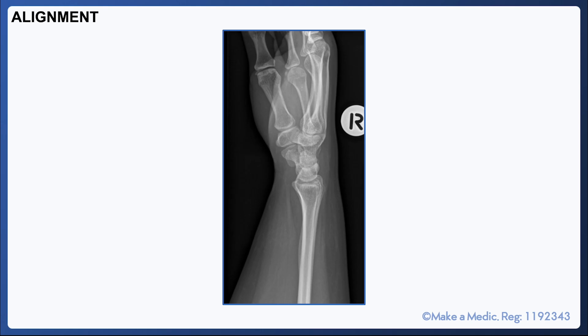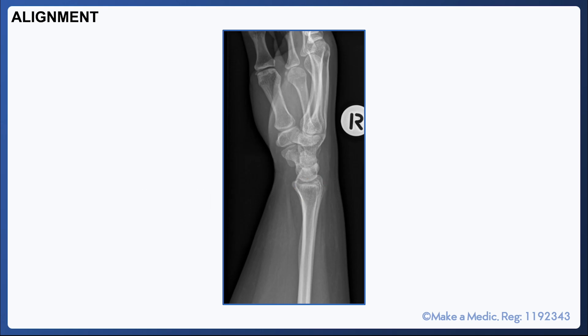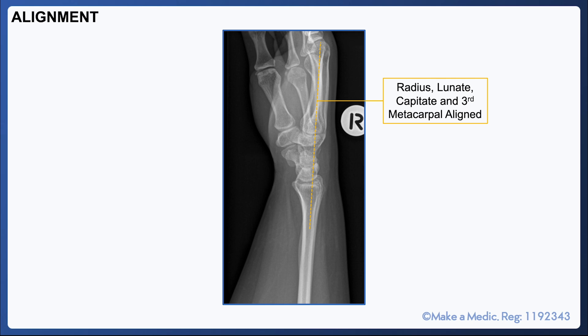On the lateral view, again there should be a smooth distal radial contour, and the radius, lunate, capitate, and third metacarpals should all be aligned.